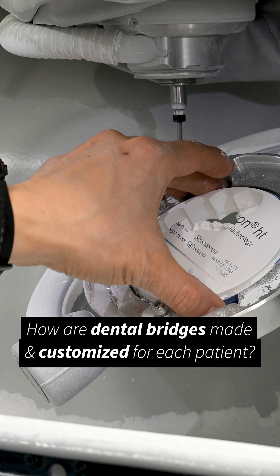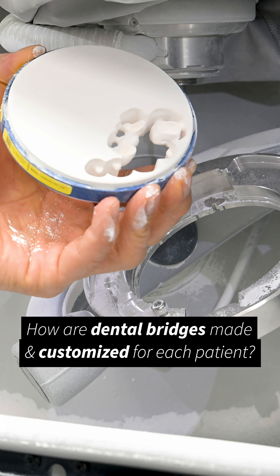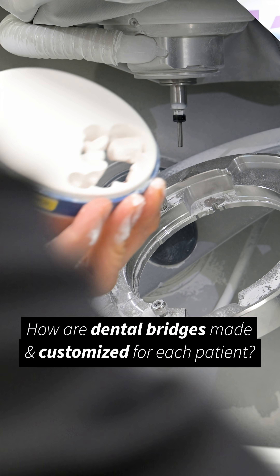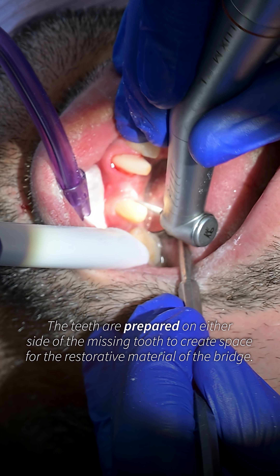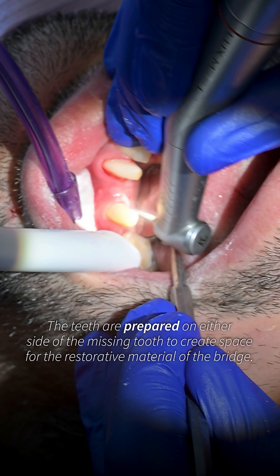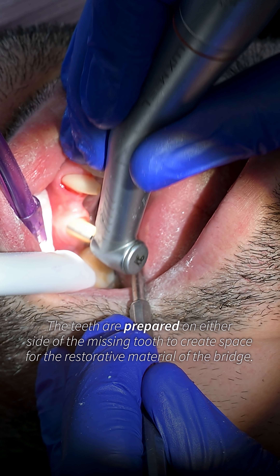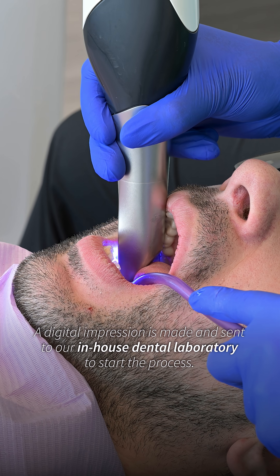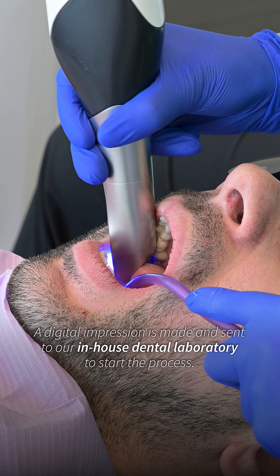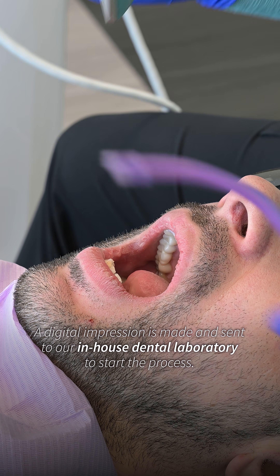How are dental bridges made and customized for each patient? The teeth are prepared on either side of the missing tooth to create space for the restorative material of the bridge. A digital impression is made and sent to our in-house dental laboratory to start the process.